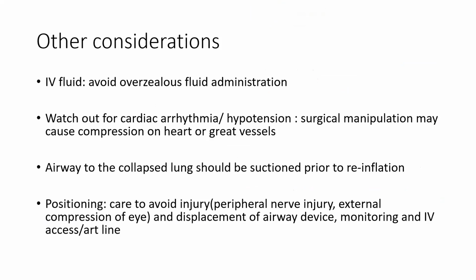We have to always remember that the airway to the collapsed lung should be suctioned prior to reinflation, because there may be a mucus plug there. Okay? And be careful about positioning in the lateral decubitus position. It can cause injury to the nerves and the eyes, and can also rarely cause dislodgement of the tube. Okay? Dislodgement of the tube would be disastrous.